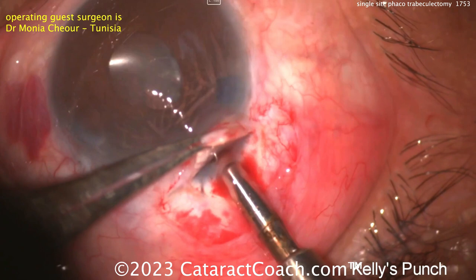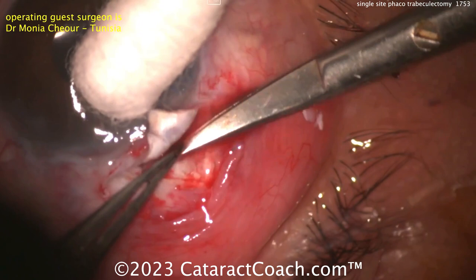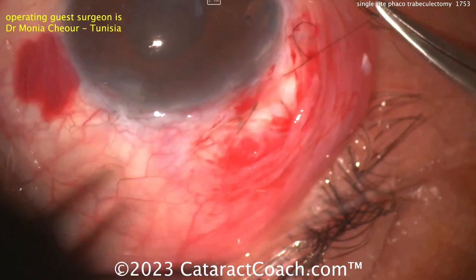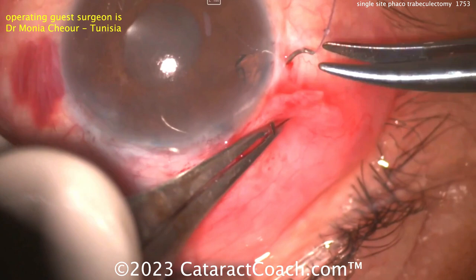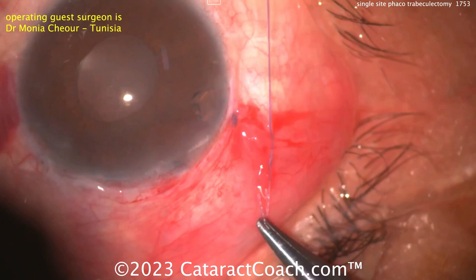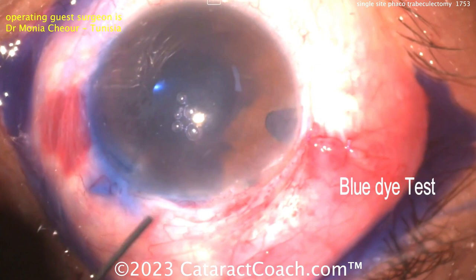Now here's the Kelly punch — Kelly punch being performed here, taking a bite of that sclera out. That looks great. And now a little peripheral iridotomy being done — a little excision of the peripheral iris there. Now using some 10-0 nylon to suture down this trab flap. Should need be, you can always lyse those in the post-op period using a laser. Now closing the conjunctiva — make sure you have a really watertight closure here, that's important. Beautifully done — single-site phaco trab. Make sure the conjunctival closure here is very good at the end.